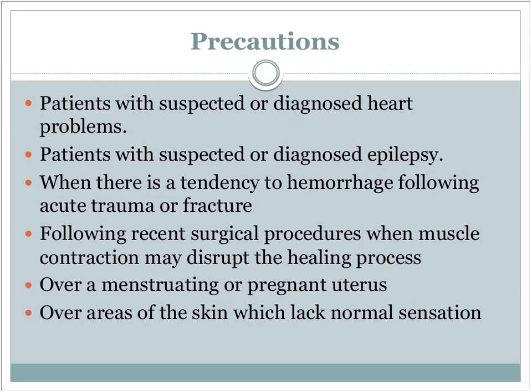So now, precautions for that, and again, these are precautions, things to be aware of, but they don't necessarily mean you can't do it. If they have a heart problem, are you going to overload the heart? Are you going to increase their blood flow and increase the preload on their heart, which is going to put more strain on the heart? Epilepsy. Are you going to trigger an epileptic seizure?